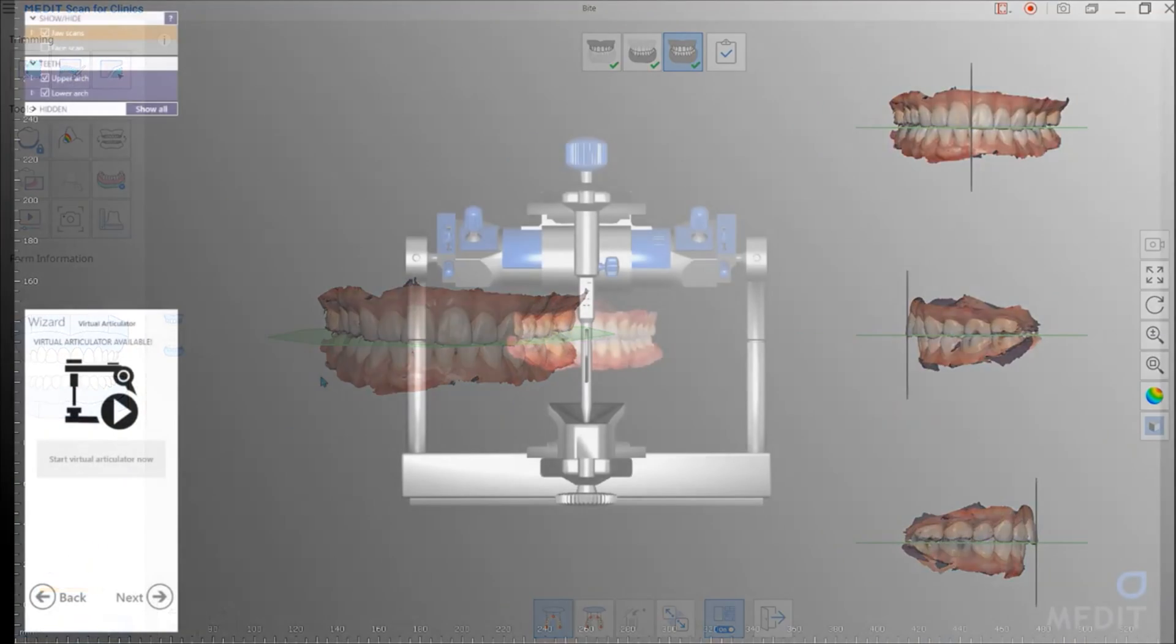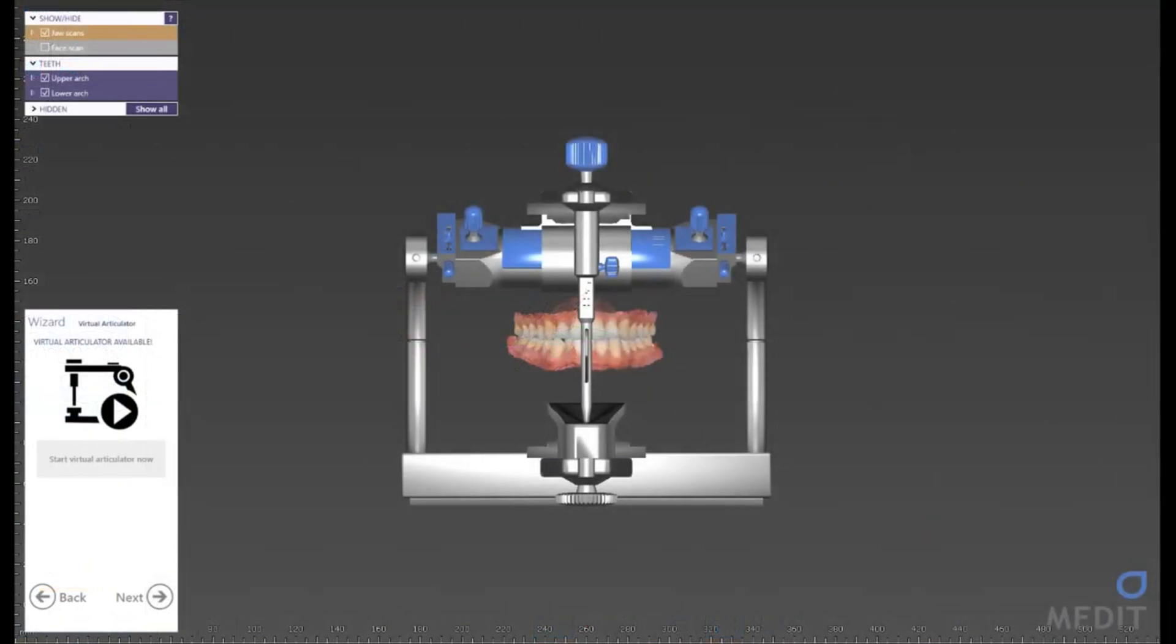When the data is loaded into ExoCAD, you see that the scanned data is properly lined up with the virtual articulator.